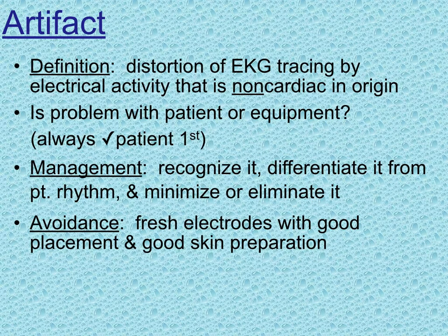So how do we manage these artifacts? Well, we need to have the ability to recognize it. We need to definitely be able to differentiate it from the patient's rhythm, and then we need to take steps to minimize it or eliminate it. There are certain ways that you can avoid having artifact. A couple of things is making sure that you apply your equipment properly, having fresh electrodes, good placement, good skin contact. In other words, if you have a hairy patient, you may need to use some clippers so that you can get good contact on the chest.